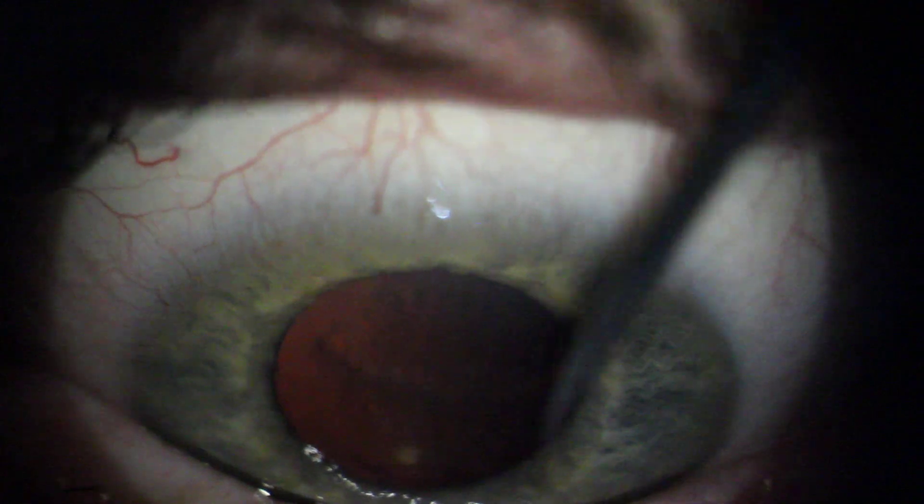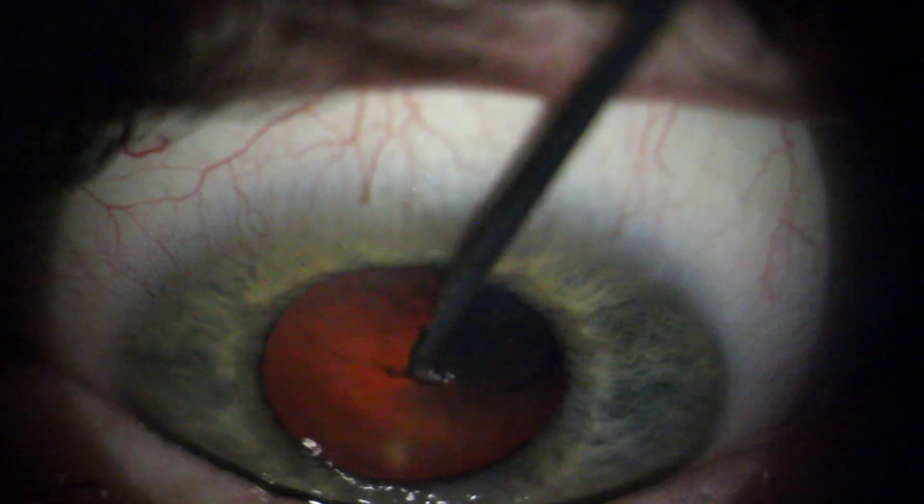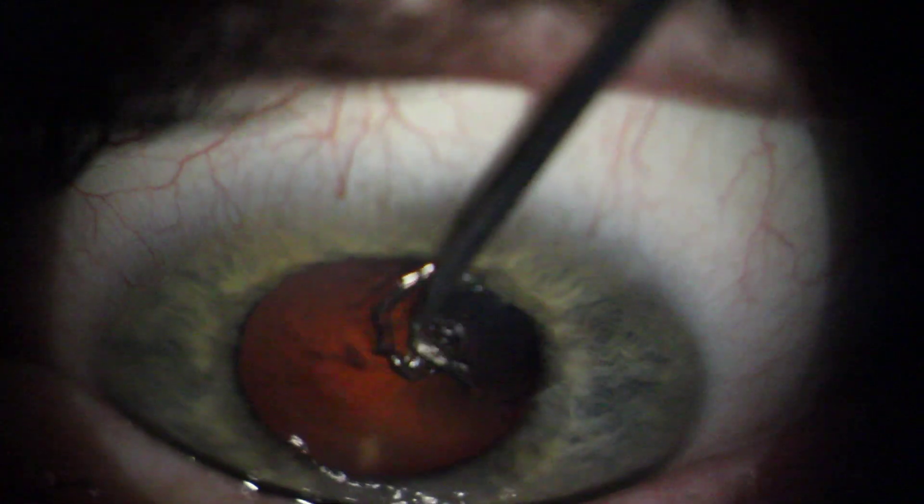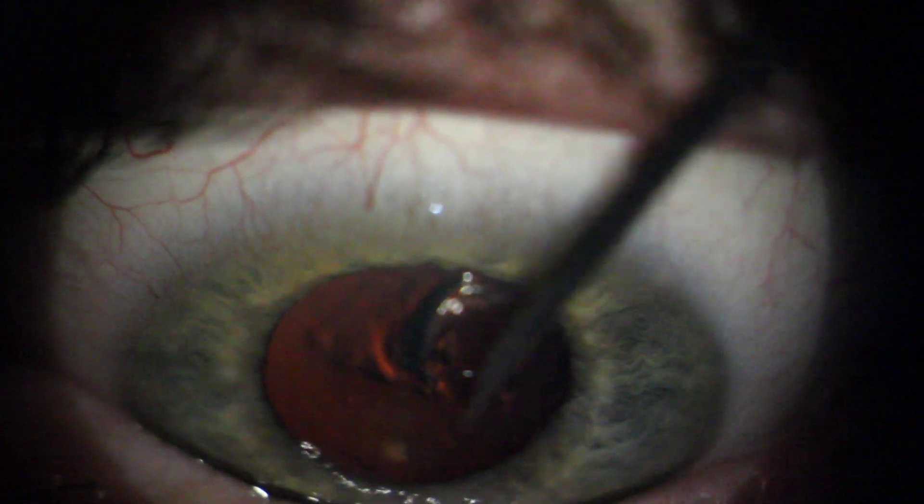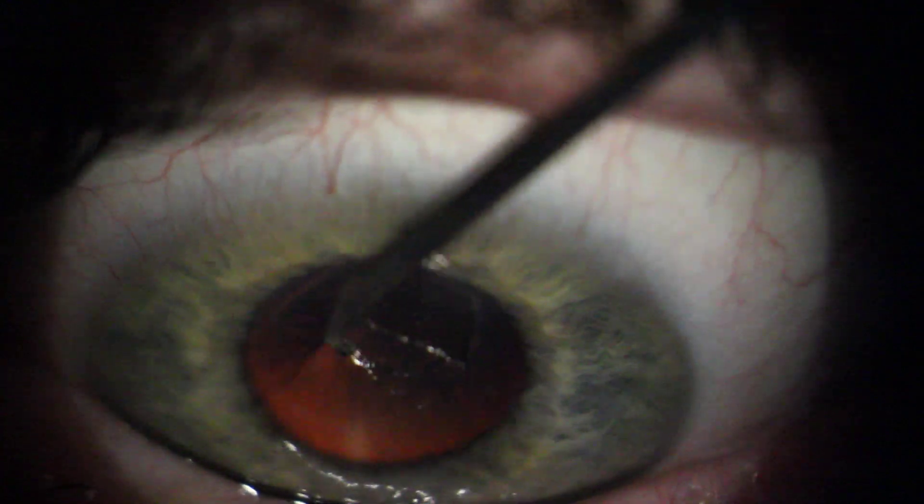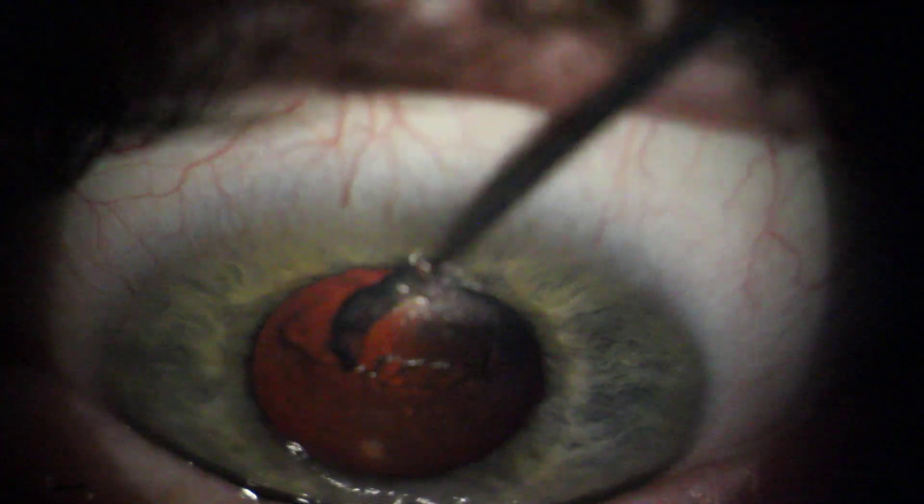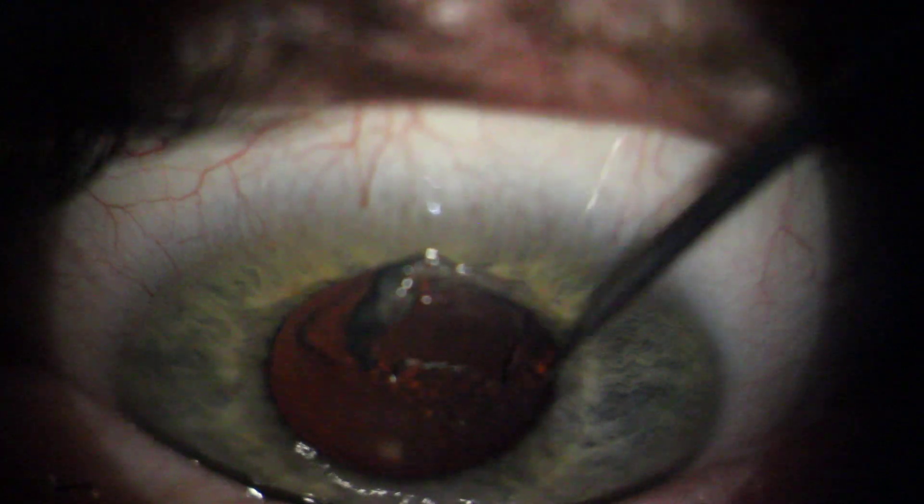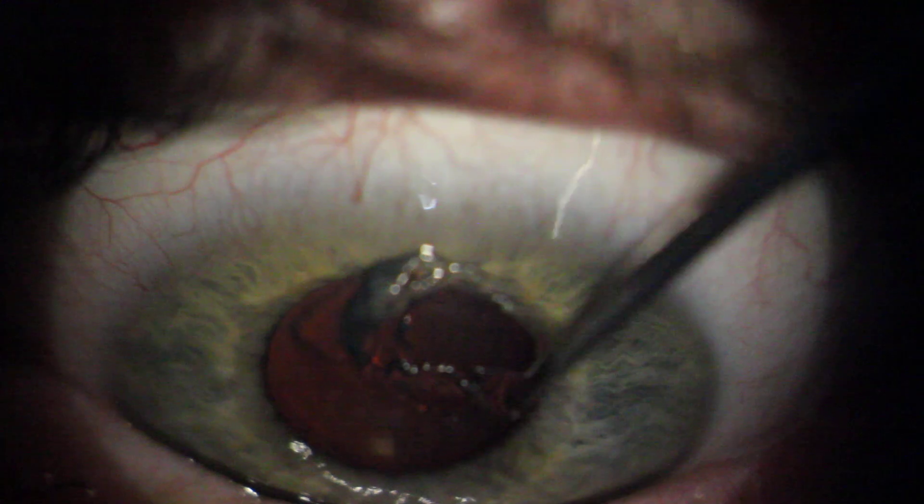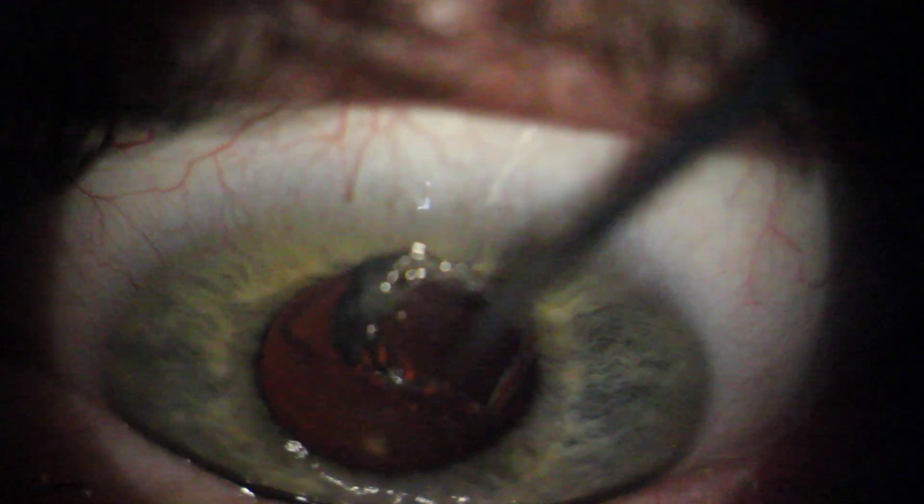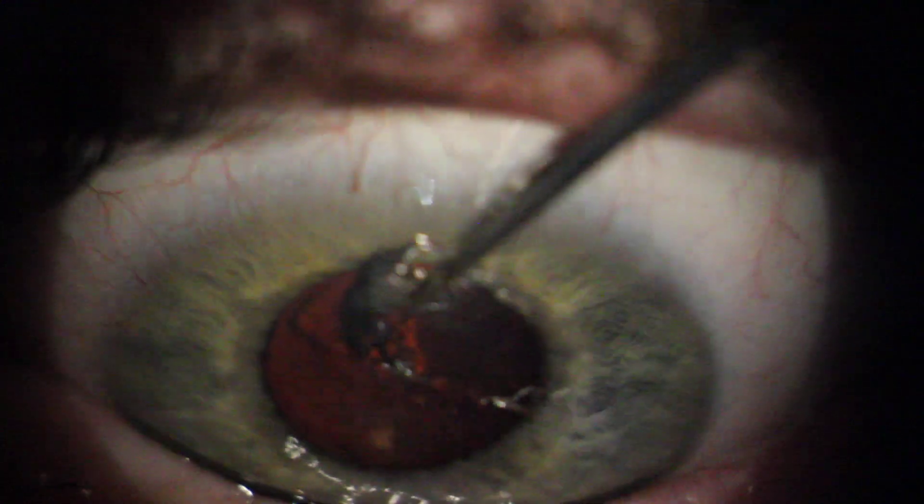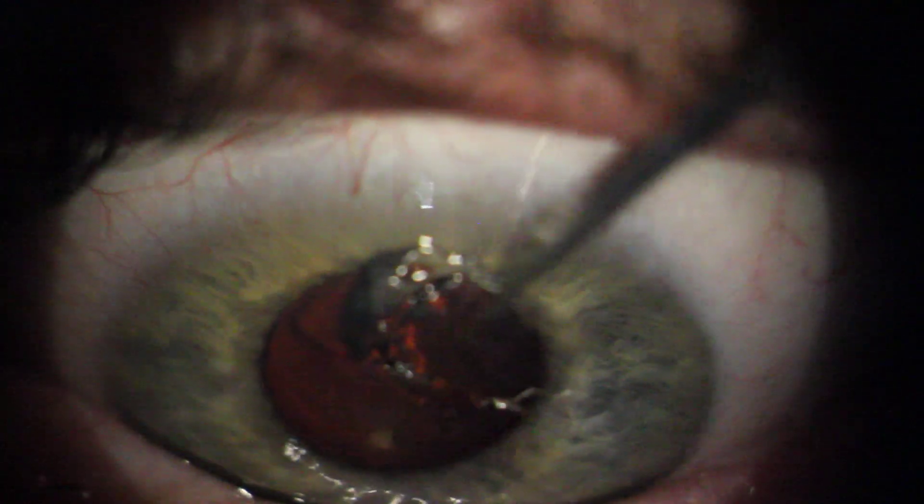There you go. Good. And then look over at this edge. Good.